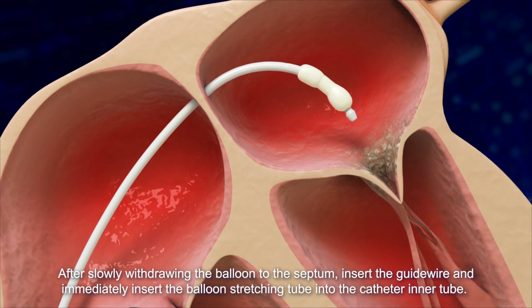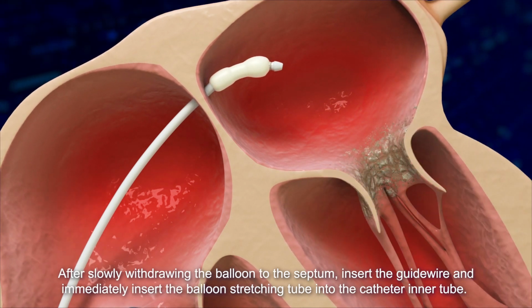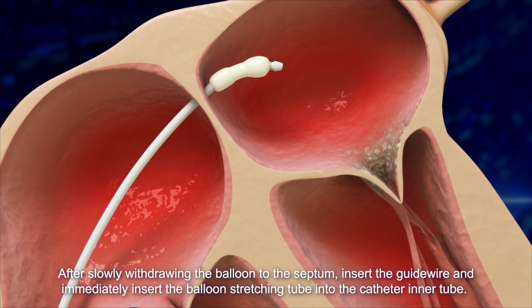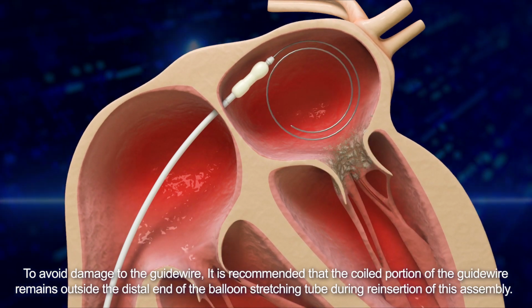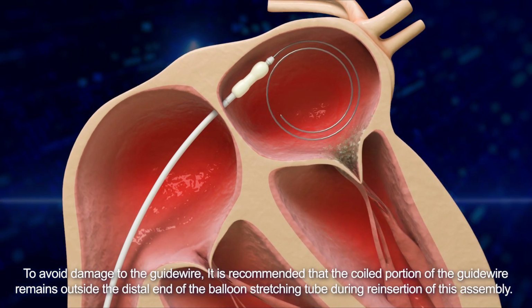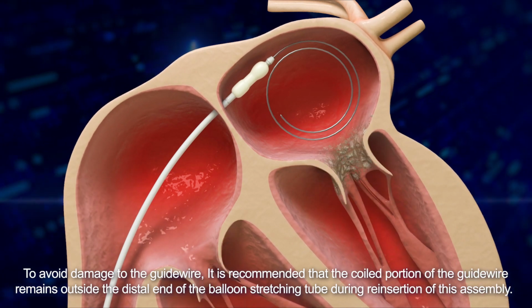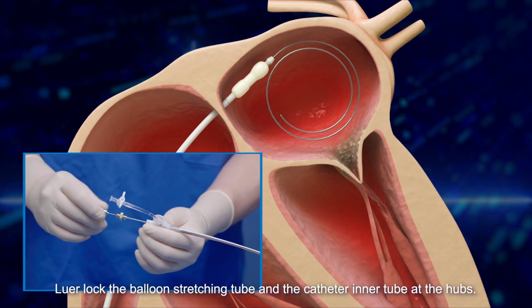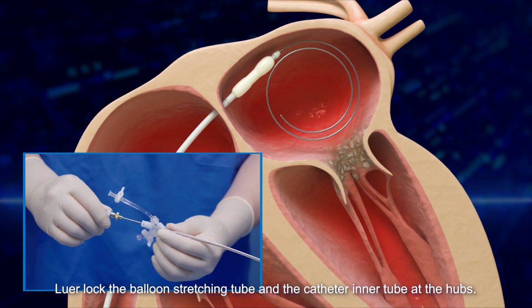After slowly withdrawing the balloon to the septum, insert the guidewire and immediately insert the balloon stretching tube into the catheter inner tube. To avoid damage to the guidewire, it is recommended that the coiled portion of the guidewire remains outside the distal end of the balloon stretching tube during reinsertion of this assembly. Luer lock the balloon stretching tube and the catheter inner tube at the hubs.